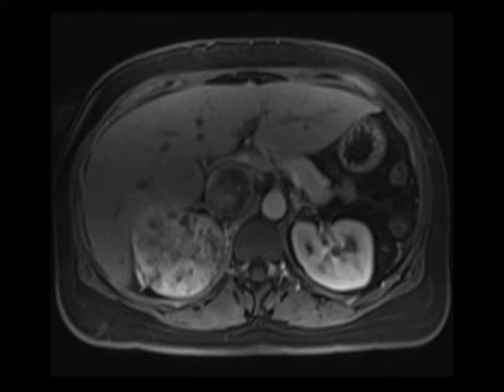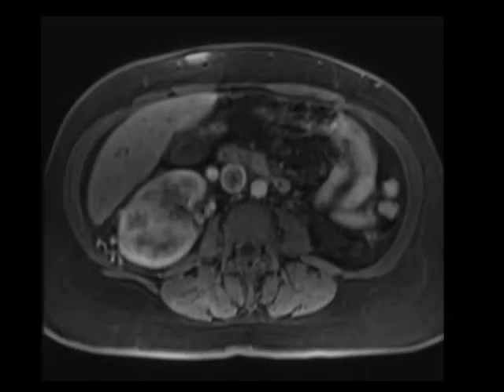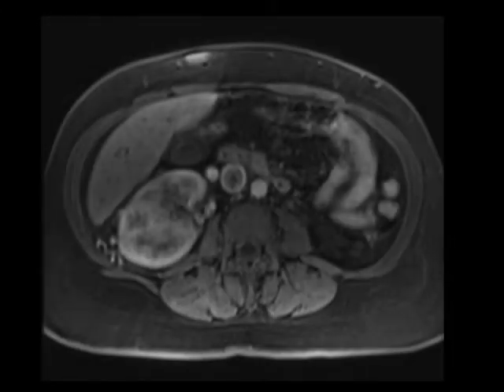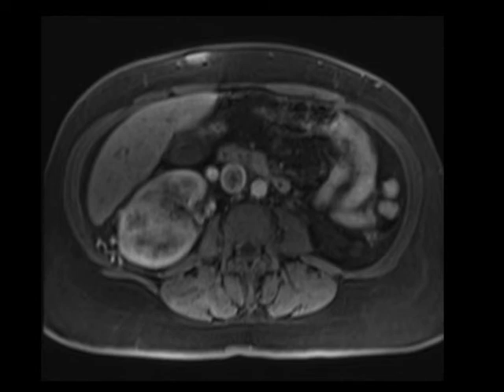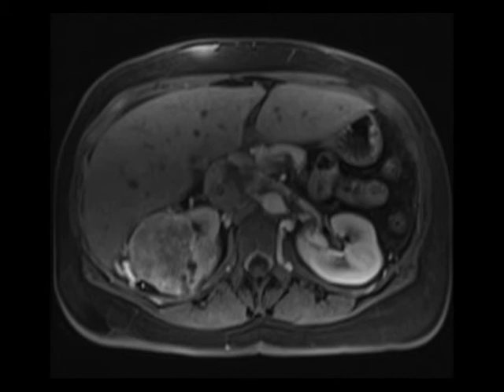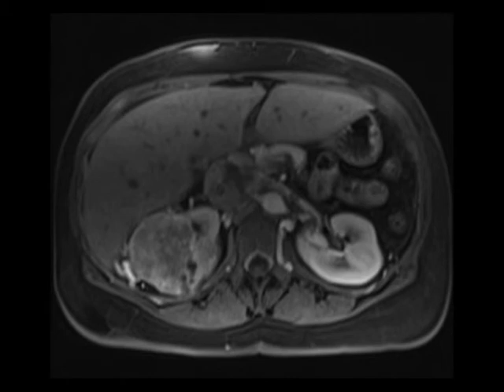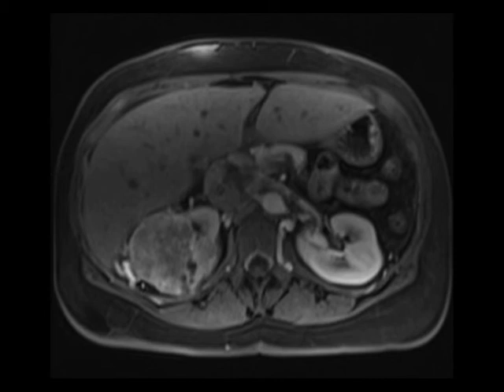But you can't simply stop there when you're looking at these cases. You have to really look at the vasculature carefully, and in some cases, look at coronal and sagittal images to really see the full extent of that vascular invasion. In this case, not only is there a large, heterogeneous RCC in the right kidney, but it's actually invading into the right renal vein and subsequently extending into and expanding the IVC.